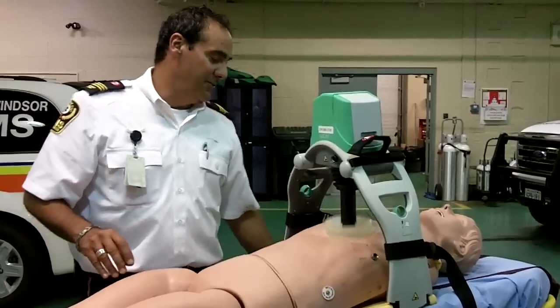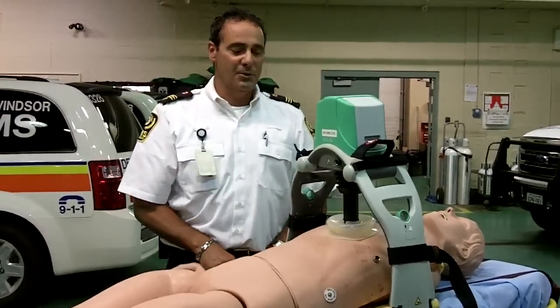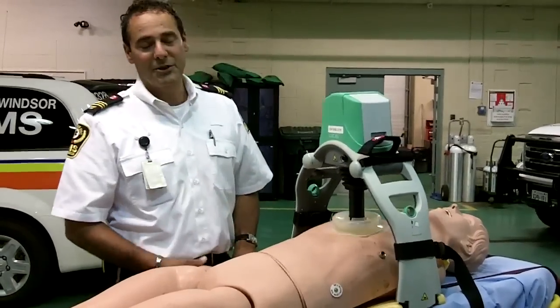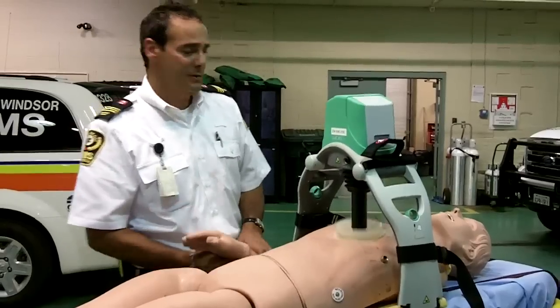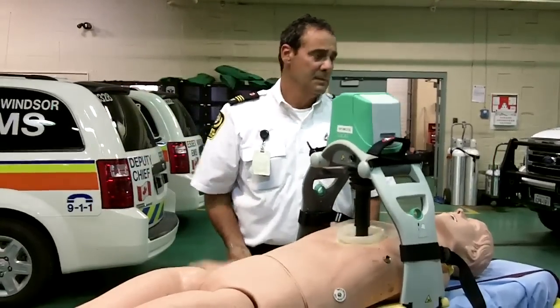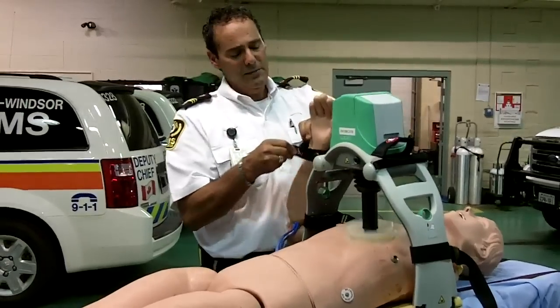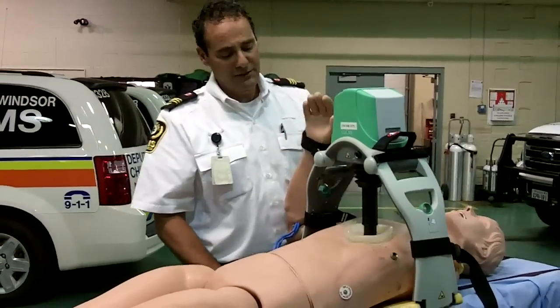It's also very helpful when we have to bring a patient down the stairs — we don't have to stop CPR. As you can see, it's stopped now; that's time for two ventilations, and then it continues. It also has an area here where we can put the patient's arms out of the way for the safety of the patient.